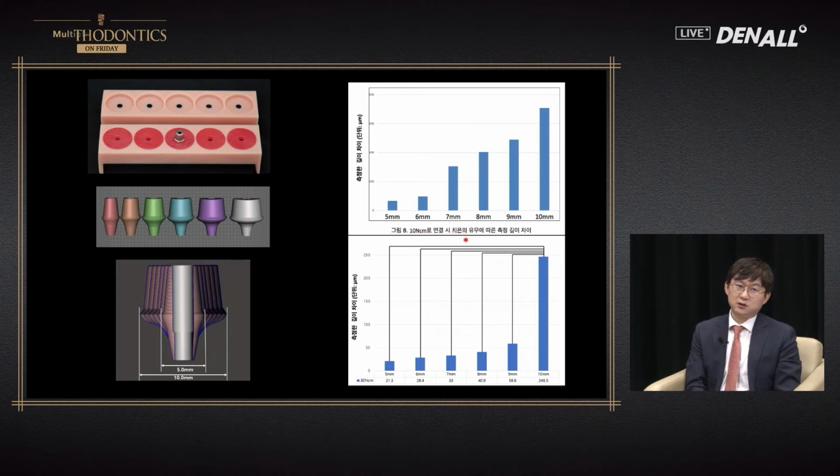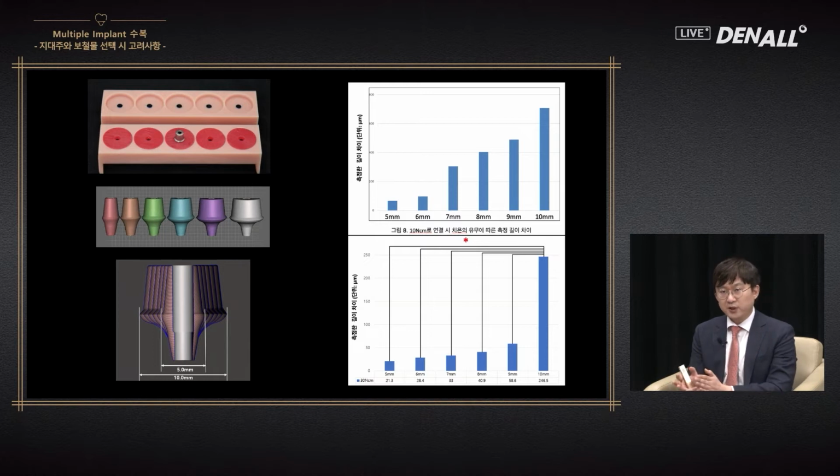In single crown cases in the posterior region with the screw type, no such problem occurred. If you look at the papers, the sinking occurs in a narrow range from 2 to 11 micron. Clinically, it doesn't sink enough to create under occlusion, but sometimes we observe the sinking.